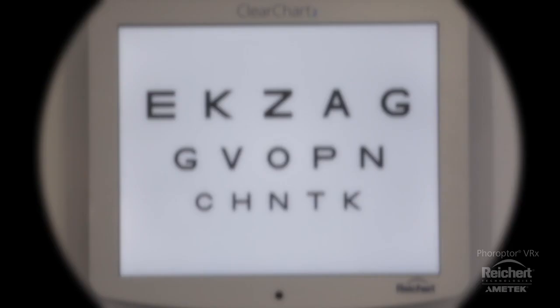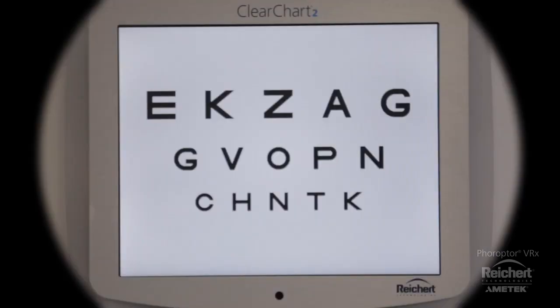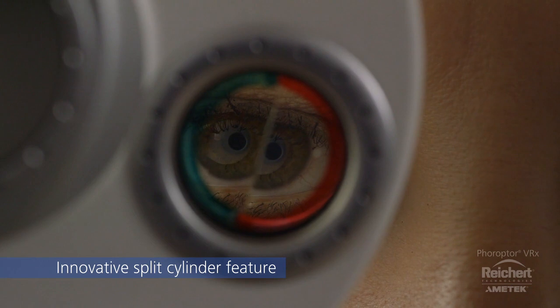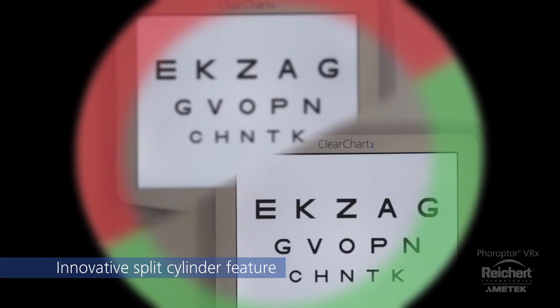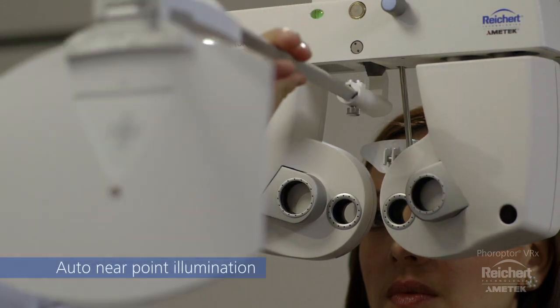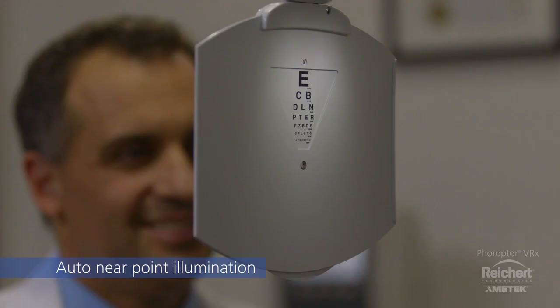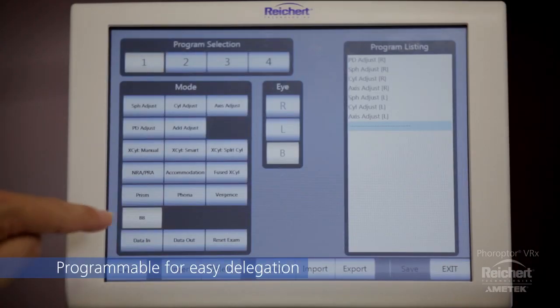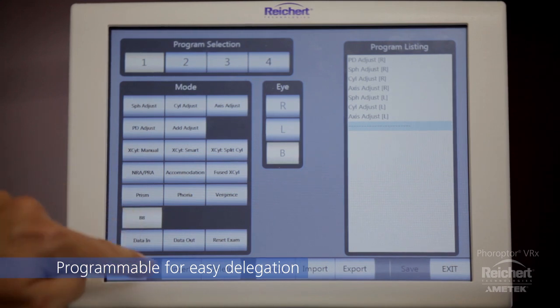Refinement of cylinder power and axis can be accomplished using the familiar Jackson cross cylinder method or the innovative split cylinder feature, where patients can simultaneously view their choices. The near point card is automatically illuminated when the reading rod is lowered into position. Choose from pre-programmed steps or easily customize your own exams to increase efficiency and allow refraction to be delegated to trained technicians.